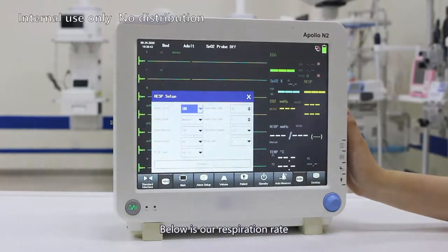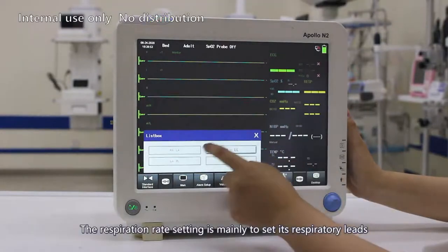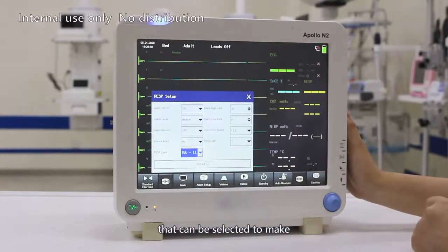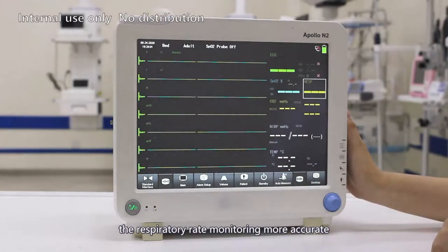Below is our respiration rate. The respiration rate setting is mainly to set its respiratory leads. There are 4 respiratory leads that can be selected to make the respiratory rate monitoring more accurate.